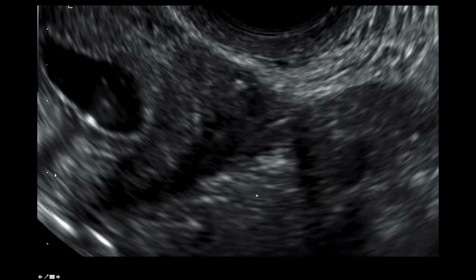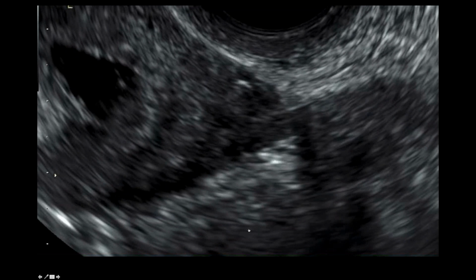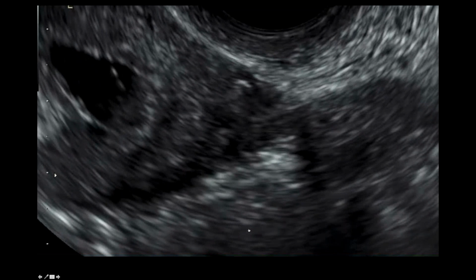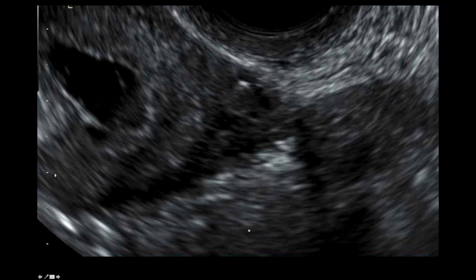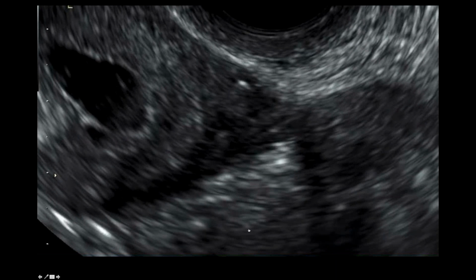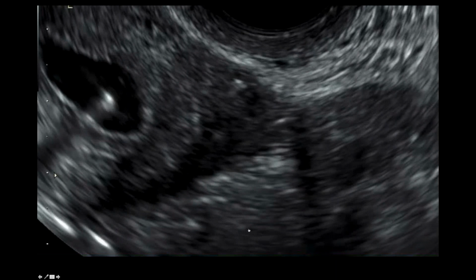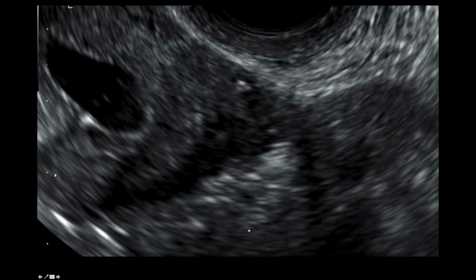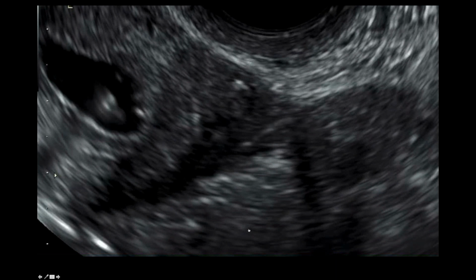But if you start out with your probe focusing on part of the endometrial cavity and where you think the cornu is, the utero-ovarian ligament on that side and the ovary on that side, then you have your maximum field of view and you're almost inevitably going to see the air coming out if it does come out through that side.